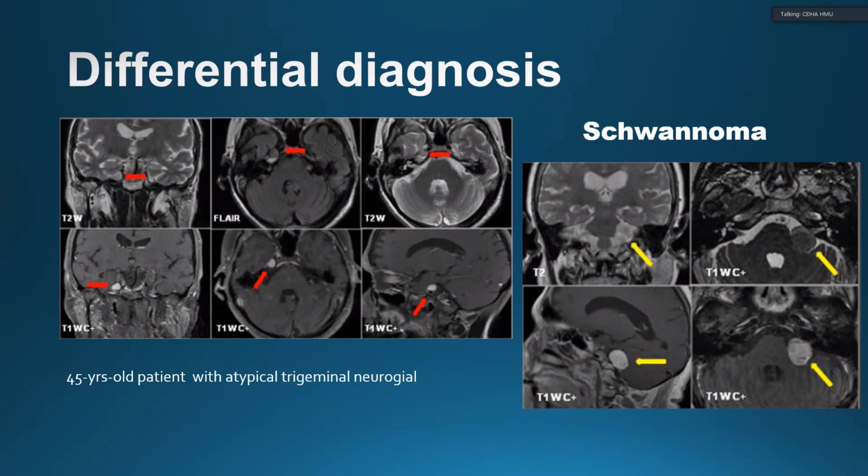The fusion is very simple when you do it on 3D. You can ask the technician to do the fusion for you, and then he sends it to the PACS. Or you can do it yourself at the workstation, and it would be better if you do it at the workstation.